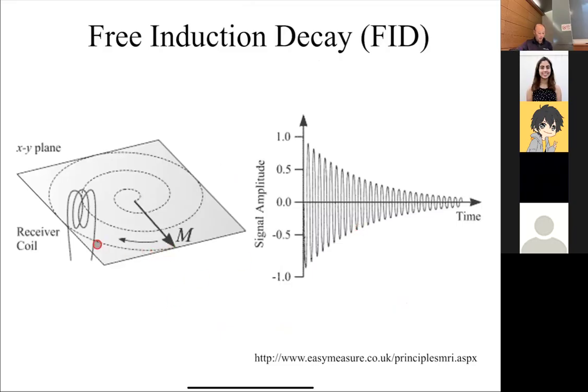It starts off here. Let's say we applied a 90-degree flip angle. So we've taken all the magnetization and put it into the transverse plane, and it's going to spiral down to here. This is what the signal looks like. Yes, that's because we stopped applying the B1? Yes, that's a great question. For most MR experiments, you apply a B1 pulse, and typically it's a pulse. There are other experiments where you can keep it on for a long time, but for now, just assume we've applied a pulse, like the pulse that we looked at last class. You design the parameters, and there'll be some homework problems where you'll be looking at RF pulses, and then we stop, and then we watch what happens.